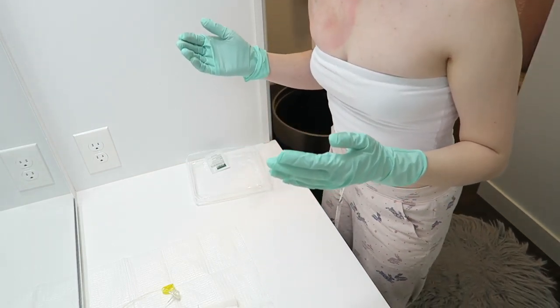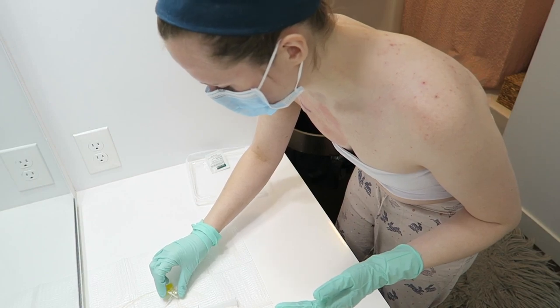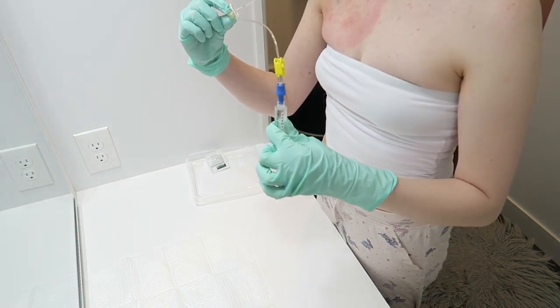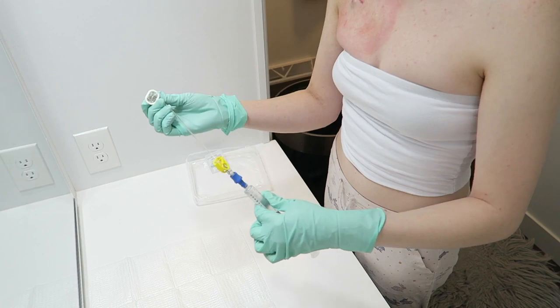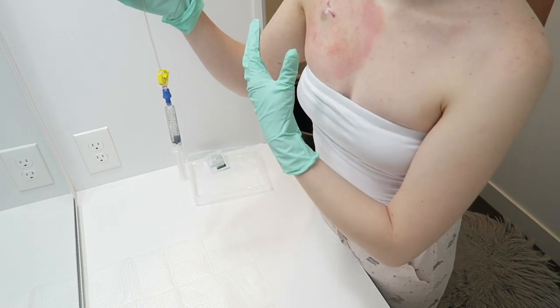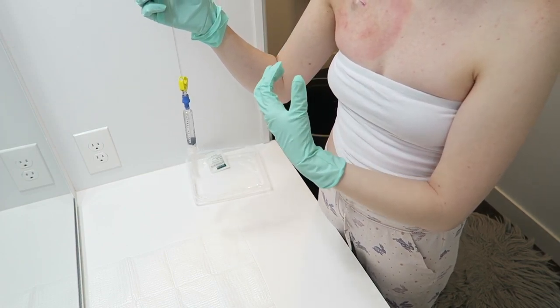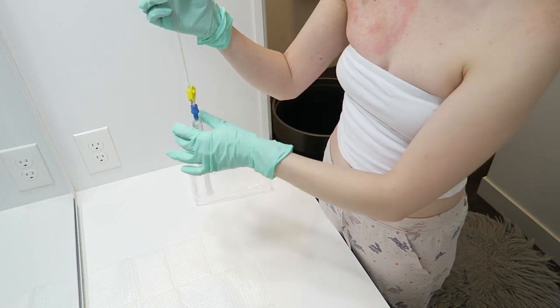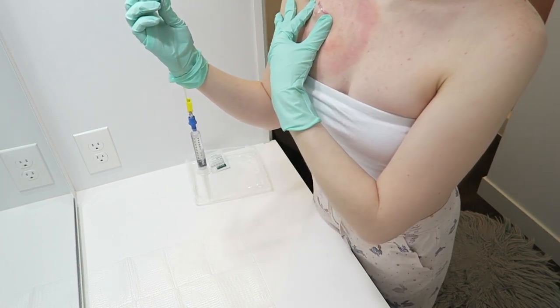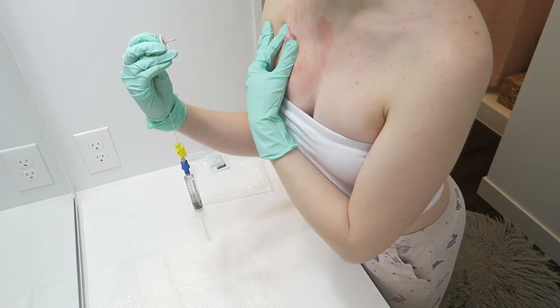So for this part, I stand up because I need to be closer to the mirror because I don't have very good farsighted vision. I'm going to take my needle and I like to access sideways, meaning the tubing is going to come out to the left instead of going straight down. It's completely up to you. So now we're going to take the end off of the needle, throw it on the floor. Now I am going to put my hand on my skin, the left hand. Technically, this means my left hand isn't super sterile. It's just considered clean, but that's okay at this point in the accessing. That's completely fine. So we're going to hold it like this. And we're gonna avoid putting the needle back into the same hole that I previously used. So we're just gonna move it over a little bit.